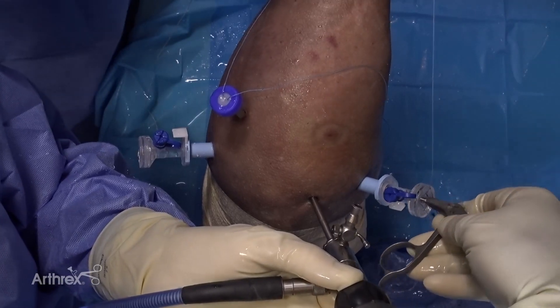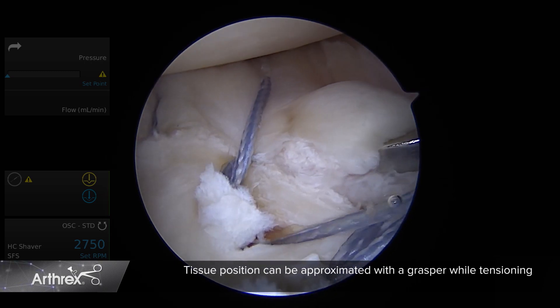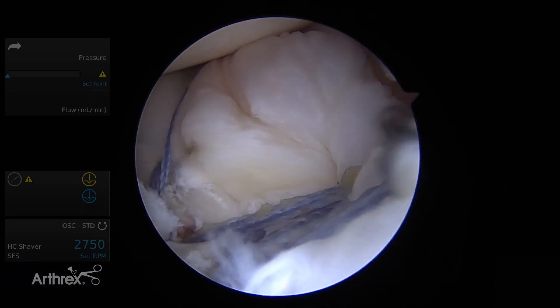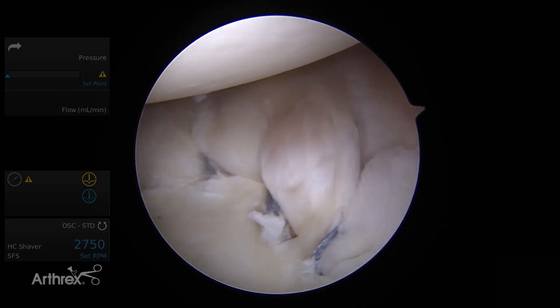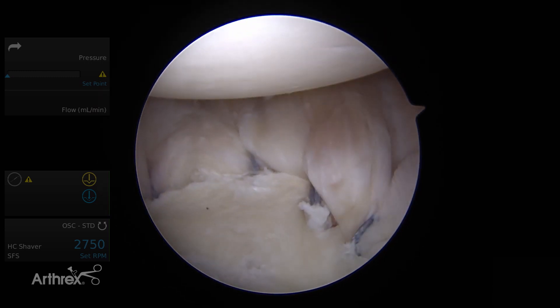Once we have all our anchors placed and our sutures passed, it's time to tension our repair. I like to use a grasper to position the tissue while tensioning the anchors, which typically involves shifting the capsule labral tissue superiorly and laterally. You can see our final repair — we have an anatomic repair of the labrum with excellent tension on the capsule as well. Thank you for your time and I hope this demonstration has been educational.